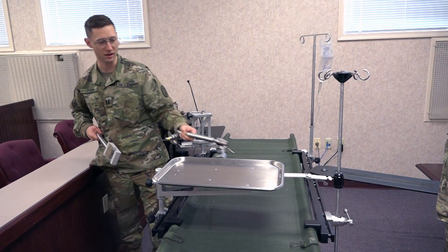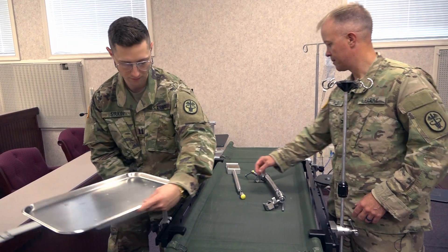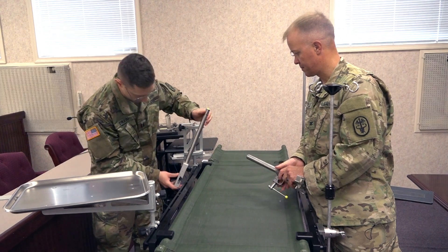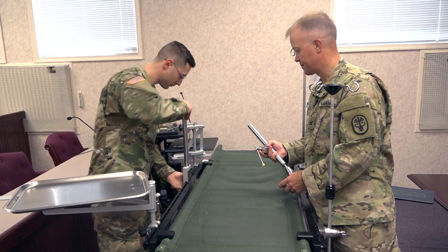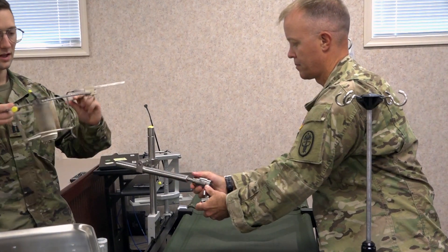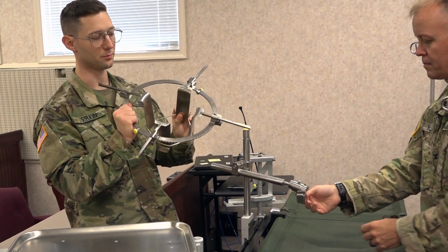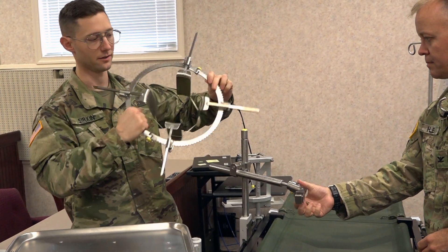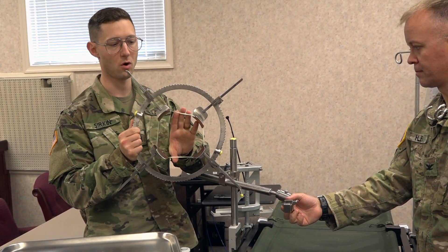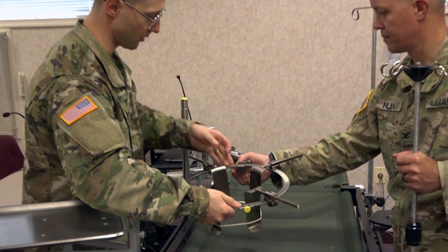Here we have the pieces for a Bookwalter self-retaining retractor. This attaches to the rail here — that's an arm for the retractor. This is an already assembled Bookwalter retractor with the retractor blades being held in place by a rubber band. If this was in a patient, it's the abdominal wall or the cavity wall of the patient that would be holding these retractors apart — so that's just simulating that right now.